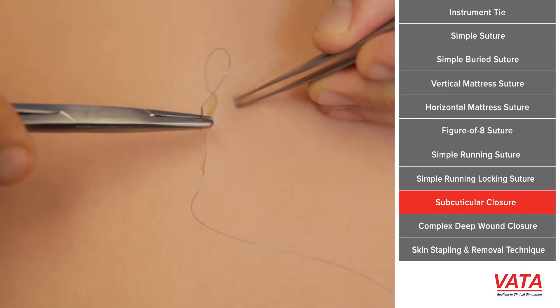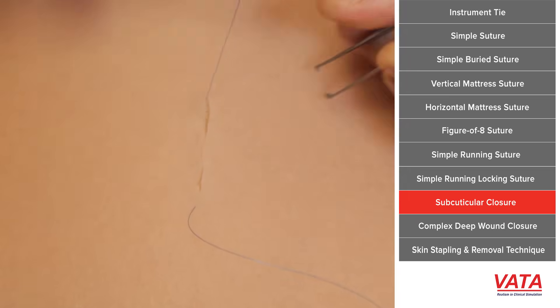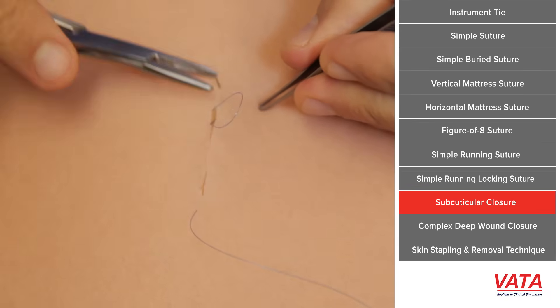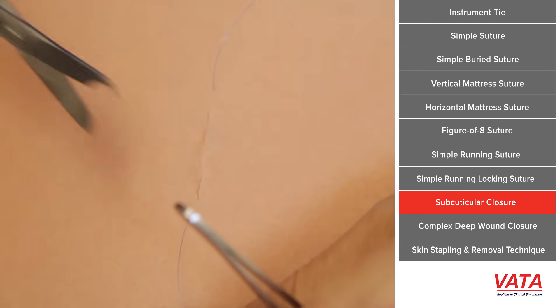If you're hoping to pull this stitch out later — say after a week — then you'd want to advance more each time. If you know it's a permanent or absorbable suture that's going to stay in and won't need to be removed, then you want to almost go back to the last stitch each time. There are different variants, but the key is to do the same thing each time.